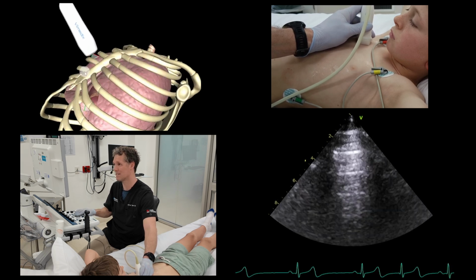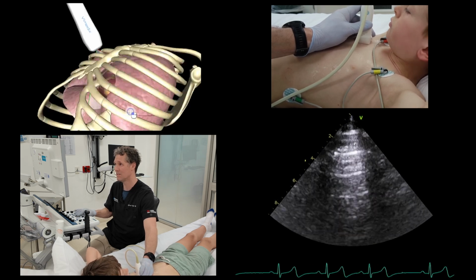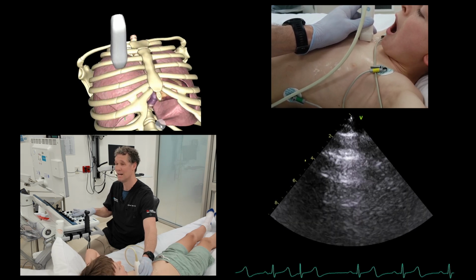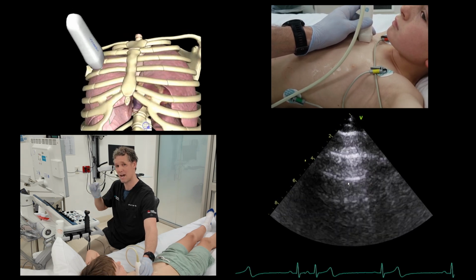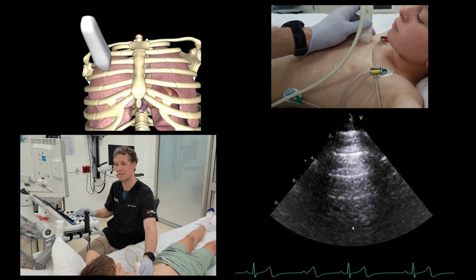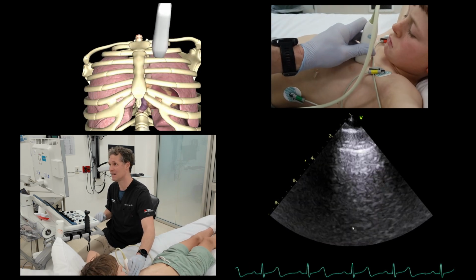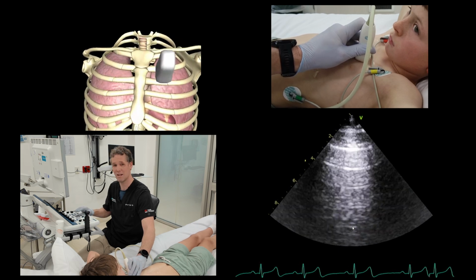And what I can see is normal lung, A lines. So this is where there's just normal aeration of the lungs. So the sound waves get bounced around between the pleura and the skin, which makes these very equally spaced out horizontal lines of decreasing echo intensity that come down towards the bottom, known as A lines, totally normal. And again, I'll look on the right side, I'll look on the left side, just nestle into a spot to maximize it. And here I can see those A lines coming down again.